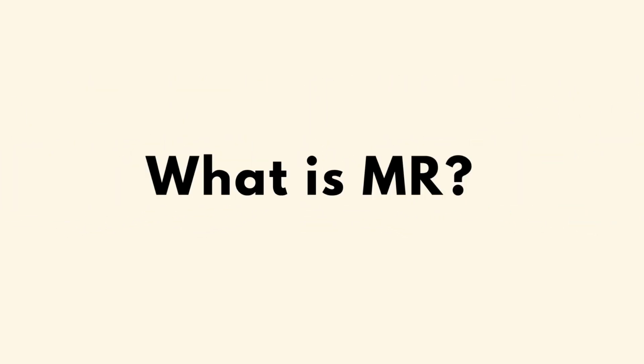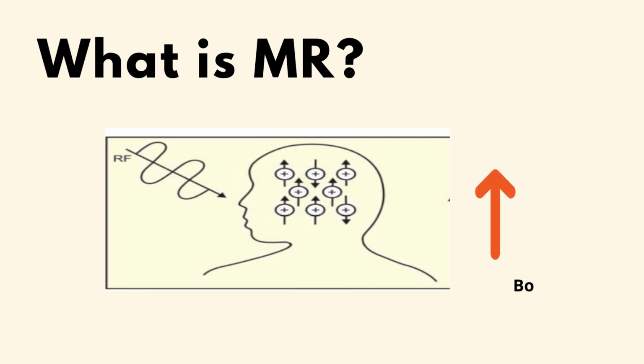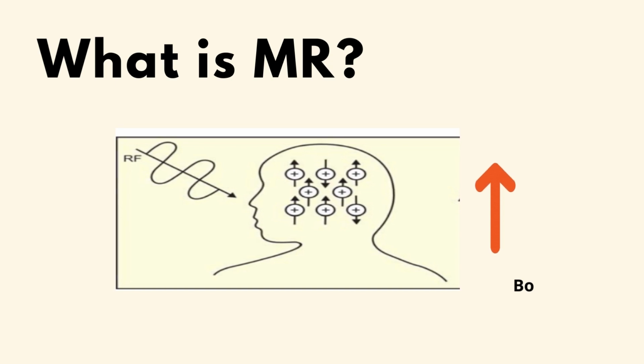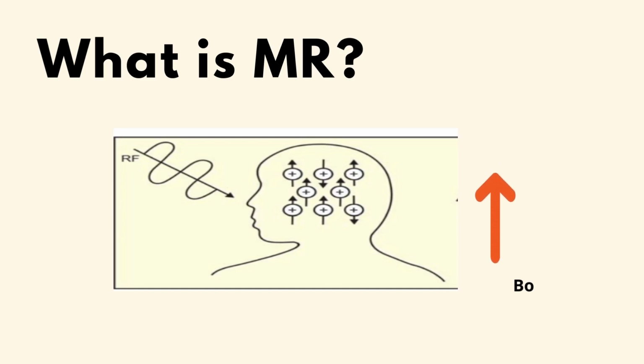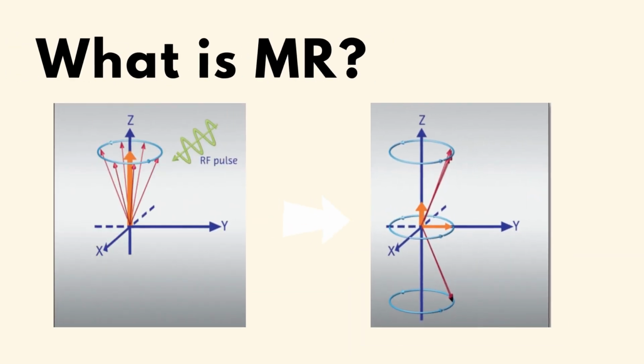Next, we will introduce the working principle of magnetic resonance. Magnetic resonance is the phenomenon in which an atomic nucleus in a magnetic field absorbs or emits electromagnetic radiation. The protons in the test area of the body will change state if a source of radio waves or electromagnetic waves, with a frequency equal to the frequency of the protons, is applied from a transmitter. When magnetic resonance occurs, some atoms move from a low energy level to a high energy level.